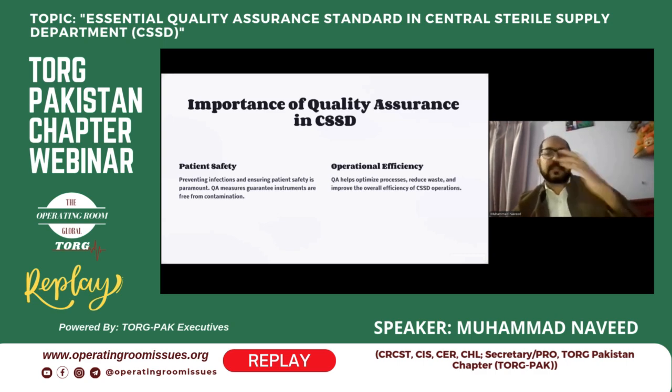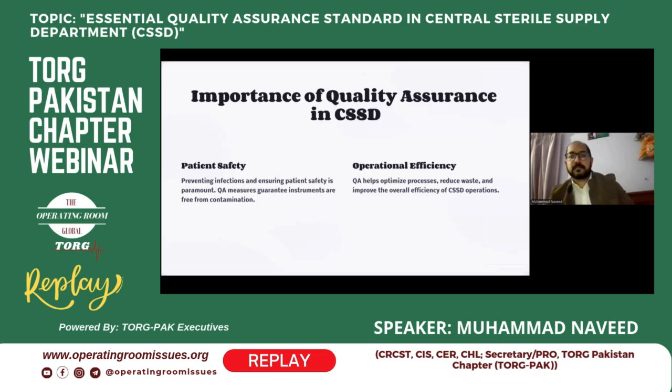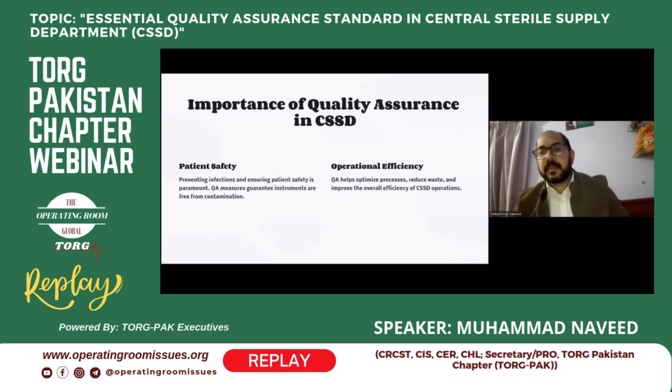Quality assurance helps optimize the process, reduce waste, and improve the overall efficiency of CSSD operations. It tells us how we can optimize and monitor the process, and reduce the waste of our time and of the many packing materials we use during the process in CSSD. Also, we can improve the indicators and SOPs, how to understand the indicators once we are using the SOPs, and how we can format the SOPs and KPIs.